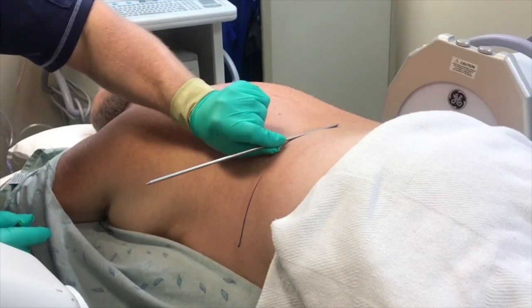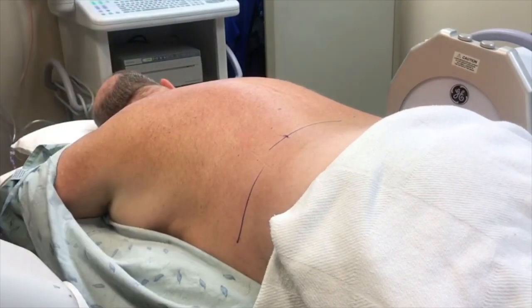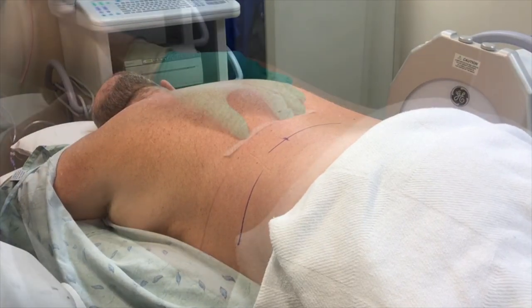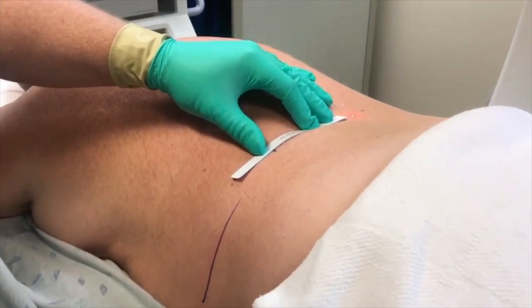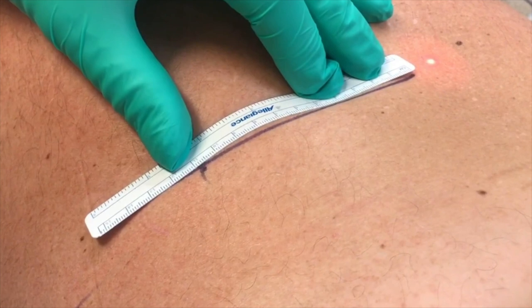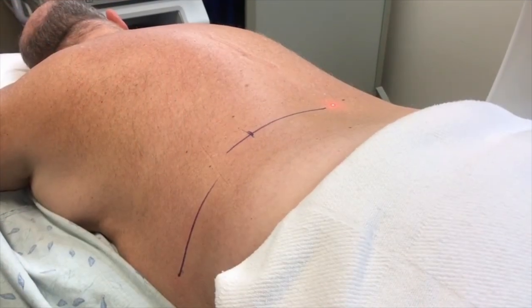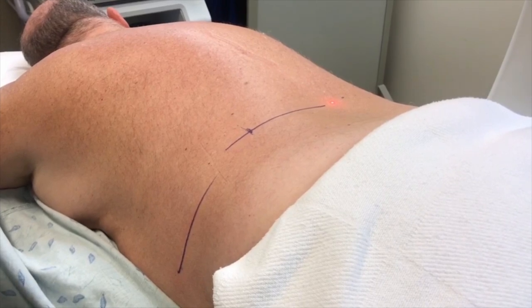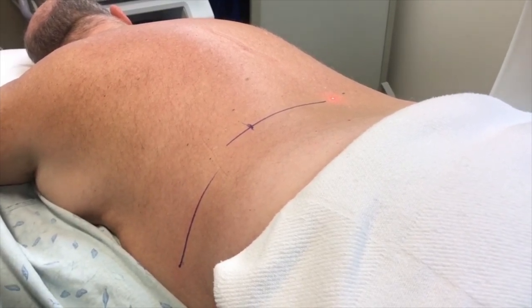That stick is now perpendicular to the x-ray. We grab the stick where the dorsum of the skin is and go that distance from midline outward — that tells you your starting spot. To confirm, we measure after making all these lines, and you can see this guy is a big guy at L3-4, and we're almost 11 centimeters out from midline, which is a little more lateral than you'd probably be on a very small female. But he basically told us where to put the needle based on his size and body habitus.